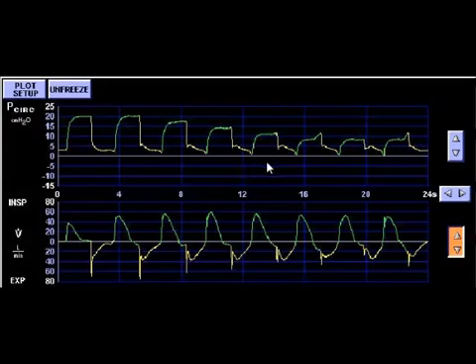Here are some things we can look at. We started out at pressure 20, and it decreased to a peak inspiratory pressure around 8 centimeters of water. We're using very little PEEP, approximately 3, in this patient here. So as you notice, it's only about a 5 centimeter water difference. The patient basically put themselves on a spontaneous breathing trial. We commonly use pressure supports of 5 centimeters of water, 10 centimeters of water for spontaneous breathing trials. So this can really wear the patient out.